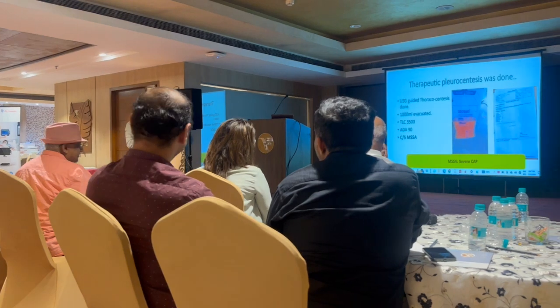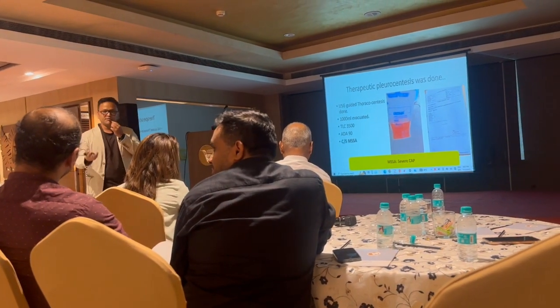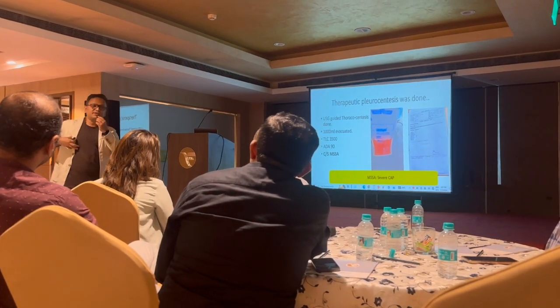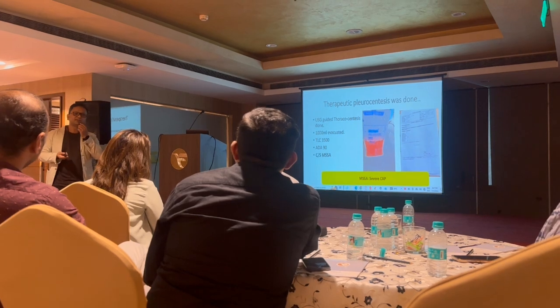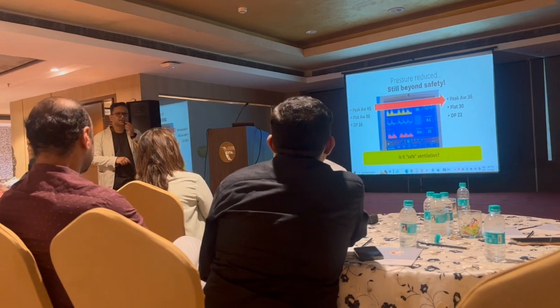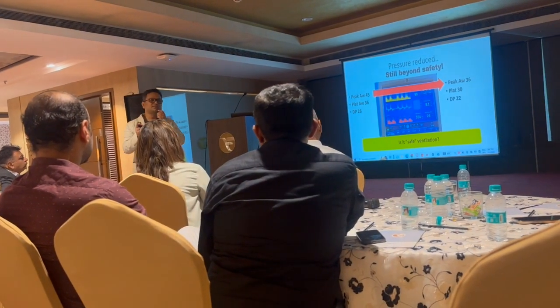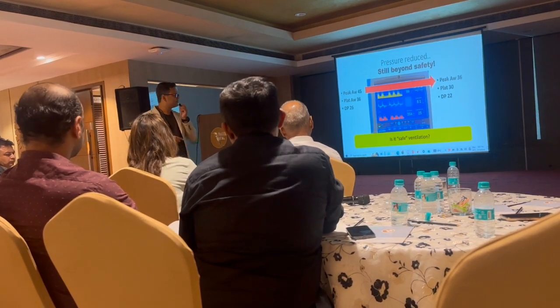So, basically, when the patient was having high peak airway pressures, apart from what Dr. Ankit has said, there was an obvious reason. The patient was having a pleural effusion. That is why the therapeutic pleurocentesis was done, draining almost 1,000 mL, which actually led to the improvement in your airway pressures. So not everything which is difficult to ventilate is purely ARDS. Things do get complicated by effusion, collapse, consolidation, atelectasis. Always remember that, right?